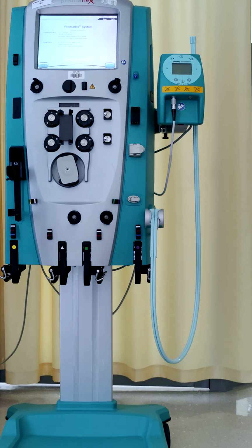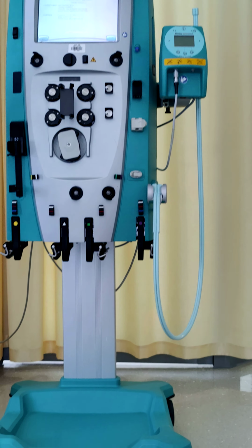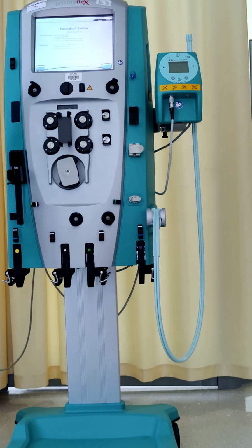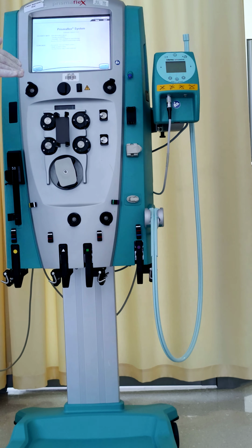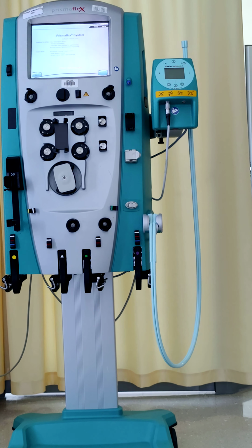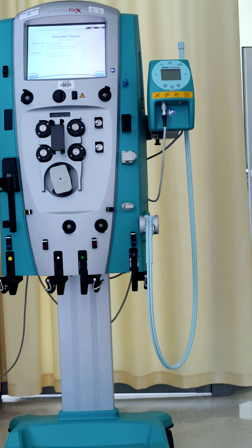For example, if the plasma volume is 3 liters and you put a replacement dose of 1000 ml per hour, it means it will take 3 hours. If you mention 1500, it means it will take 2 hours and so on. But it should also be mentioned how long the treatment is: 2 hours, 3 hours, 2.5 or anything.